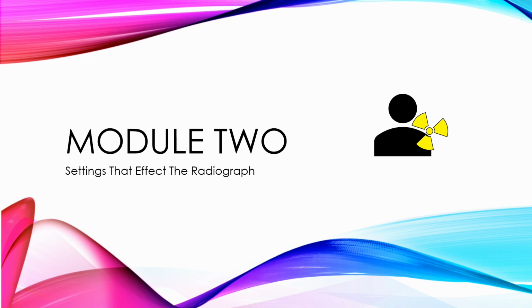Moving on to Module 2. Let's discuss the settings that will affect the outcomes of your images. Even though the settings are calibrated, they shouldn't remain the same all day. We are adhering to the ALARA concept, which means as low as reasonably achievable, which means we're promising to only take the X-rays that are absolutely necessary so that we don't expose any patient to excess radiation.